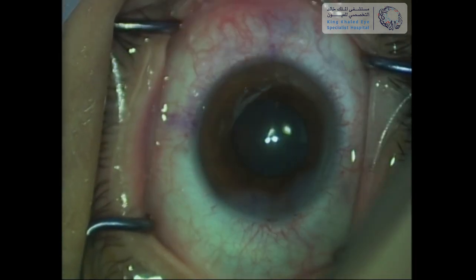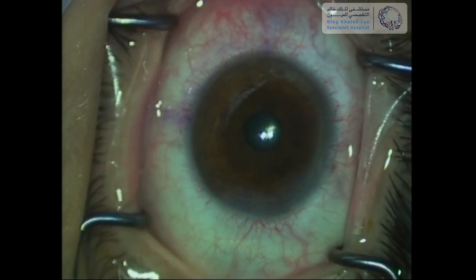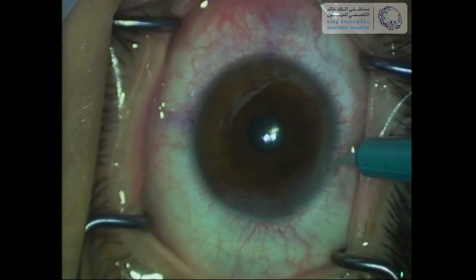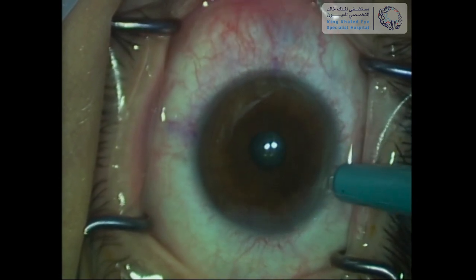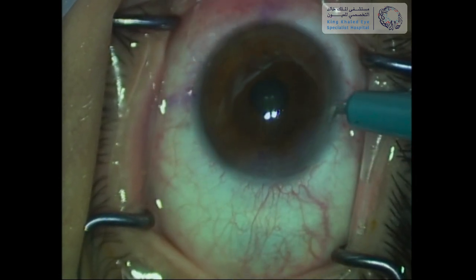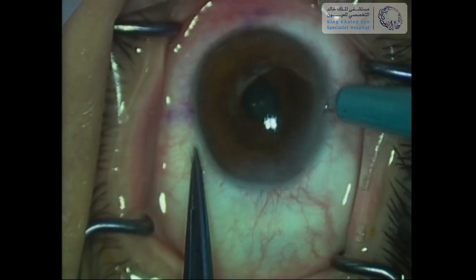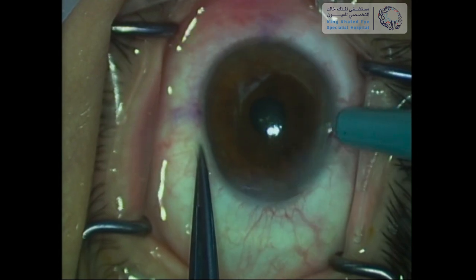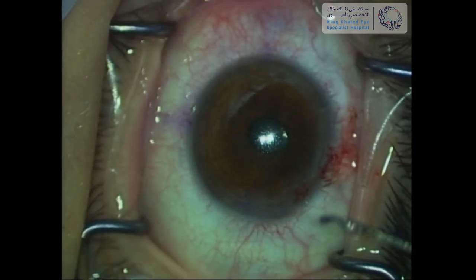Miochol is then injected to constrict the pupil. Given that this is a hyperopic ICL that does not contain a central hole, we proceed with creating a surgical peripheral iridotomy to avoid post-operative pupillary block. The side port is enlarged a little with a super sharp blade, and the surgical PI is performed superiorly to be covered by the upper lid.